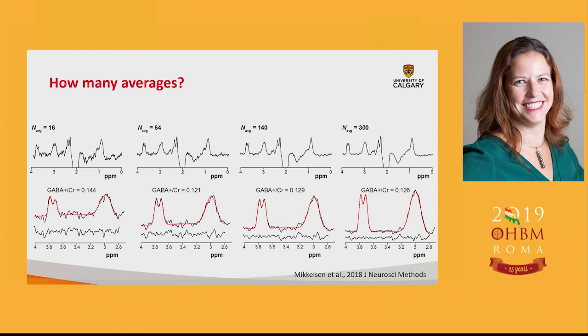You've got 3 votes for 11 minutes and 1 vote for 27 minutes. Okay. So those are actually all correct. I was a little bit sneaky, I guess, and said time versus averages, which are obviously related, but the answer, as with all of them it feels like, is it depends. It depends on the question you're asking, it depends on how big your voxel is, and it depends on your conditions.